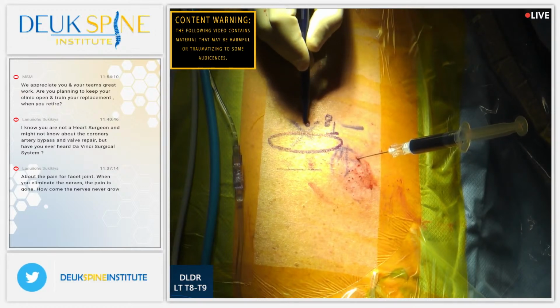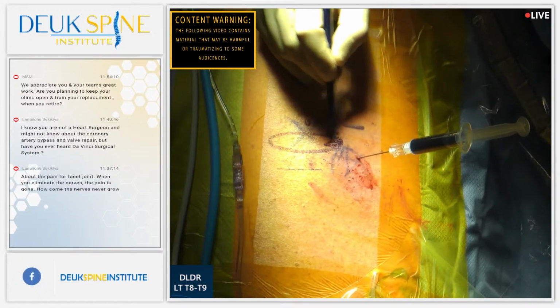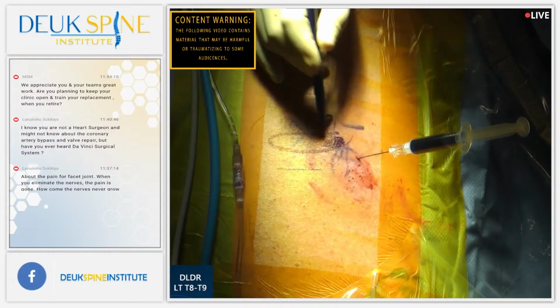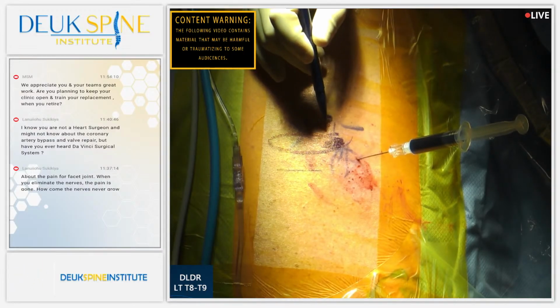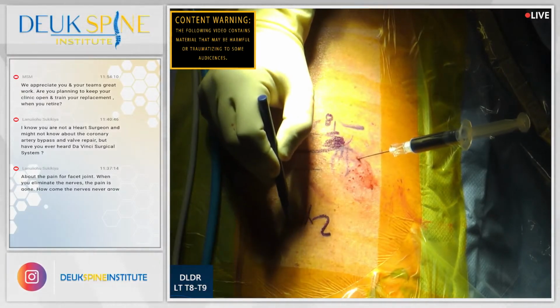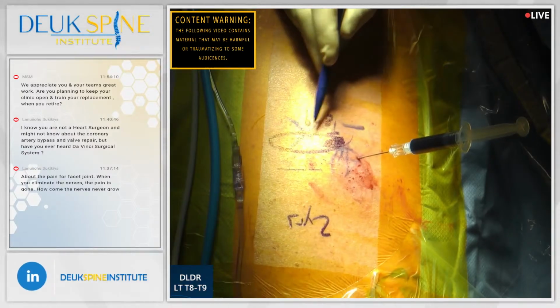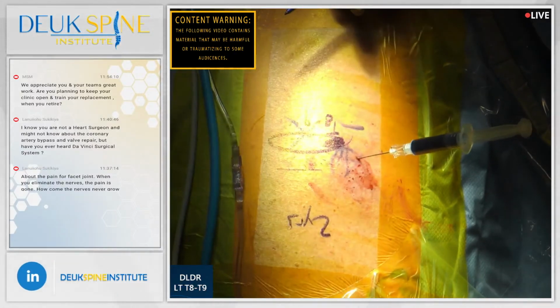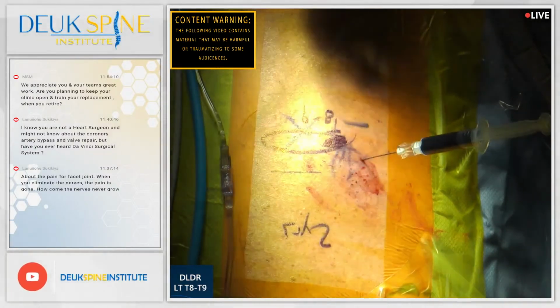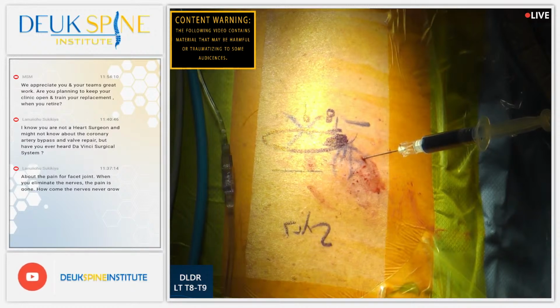Honestly, sometimes I don't know how we do it, but this is the T8-9 thoracic disc. His MRI shows he's got a herniation, and you can see there's evidence of inflammation here. He's had really bad back pain for 2 years, right here, like literally right there. You can see the X mark from before surgery. Yes, we can. It's literally lined up with the disc. So I believe we're at the right place. The other discs look okay on the MRI. So hopefully this is it.